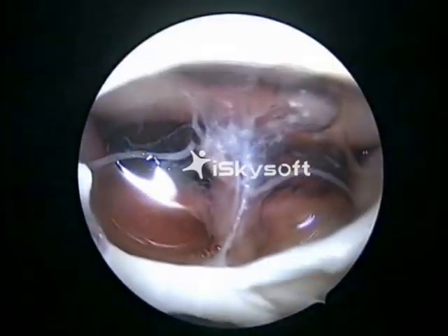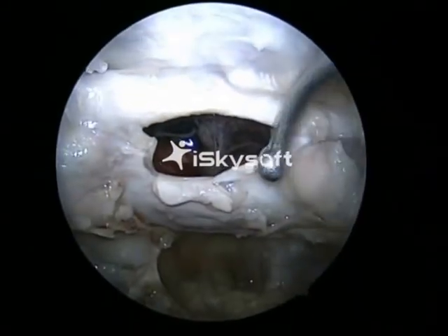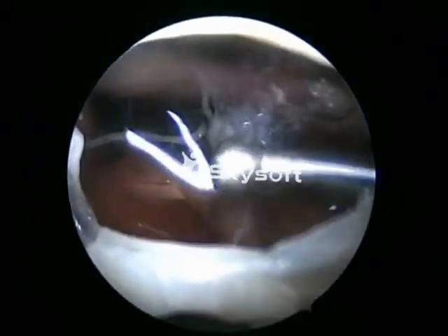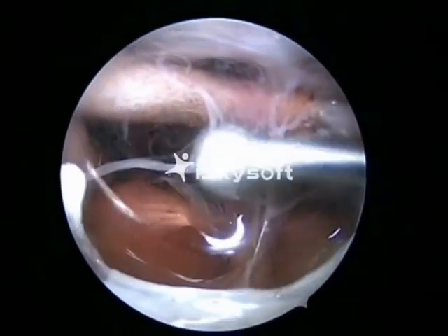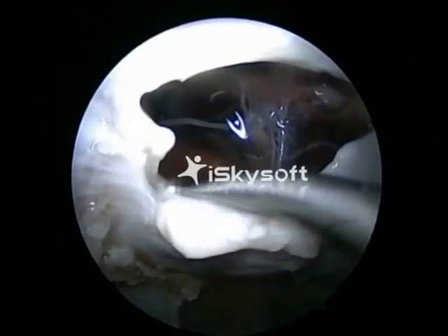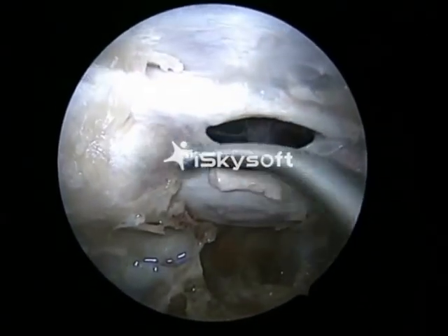And the structures we see are the superior hypophyseal artery on the left of your picture. That's the superior hypophyseal artery. That's the optic chiasm above. That's the internal carotid artery.